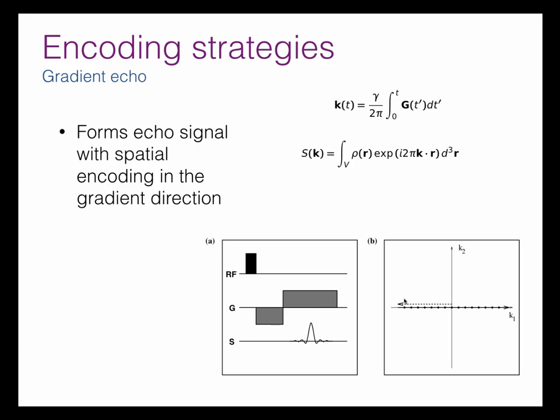The initial gradient pulse here will drive us to the left-hand edge of k-space because it's like a velocity in a negative direction. And then we reverse the gradient and go the other way, and we sample as we go, and we collect this echo. And as we cross through the middle here, we get the echo peak. And that's considered the time to echo for a gradient echo sequence. And so these little dots here represent collecting samples. Okay.